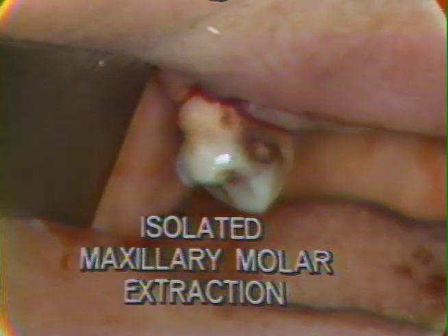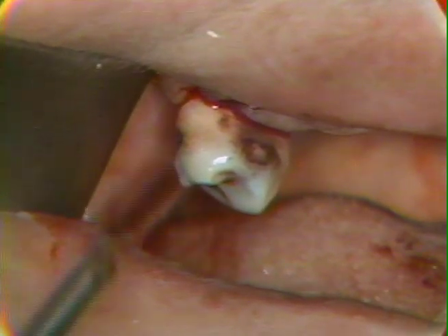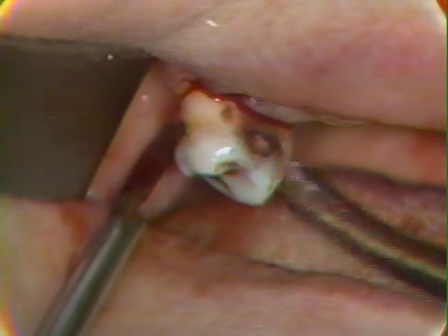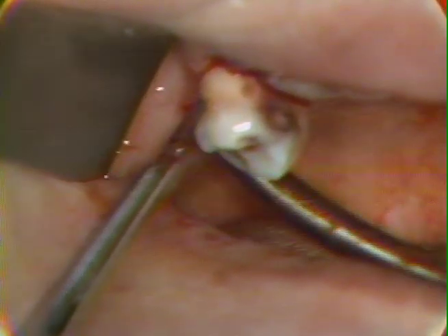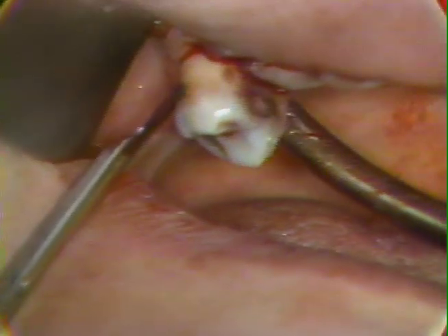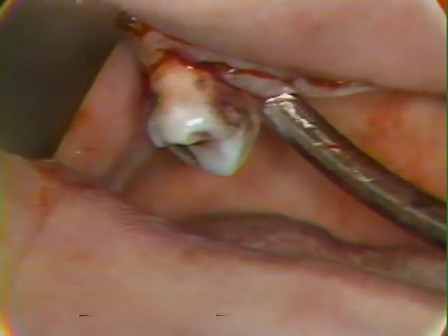We'll extend our incision posteriorly, and then we'll try to reflect the flap from the buccal. I'm sliding in now. You see the patient's mouth is partially closed together. And with that jaw partially closed together, I can get way back here and intervene to get the access that I need. Whereas if she had her mouth propped widely open, I would not be able to do that.